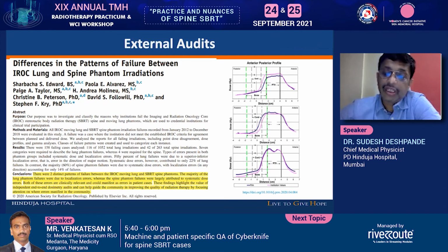So they raised the question about the accuracy of the planning system or the setup errors. This external audit can help you evaluate your planning system configuration, and if there is some error in your setup, that can also be identified with external audits.